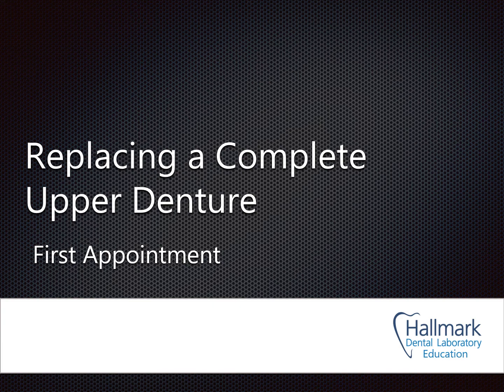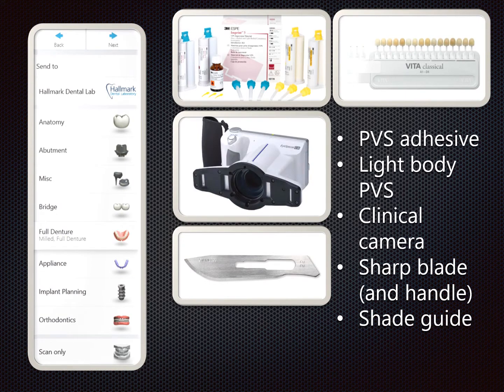Welcome to Hallmark Dental Laboratory Education. In this presentation I will be showing how to replace a complete upper denture using an intraoral scan. I'll be demonstrating using the TRIOS scanner and TRIOS software package for this application.